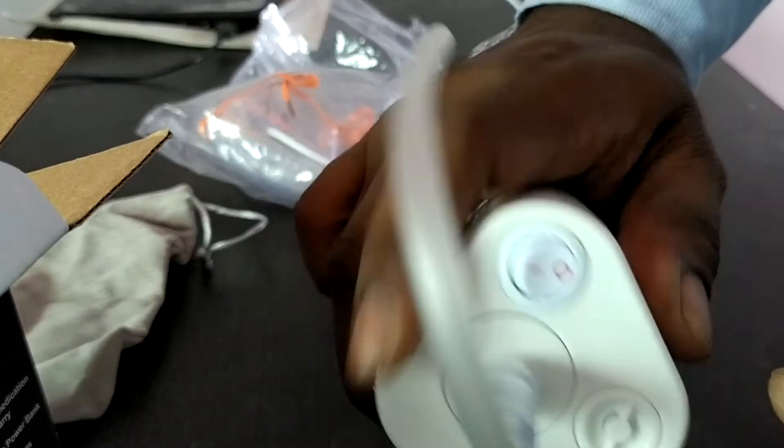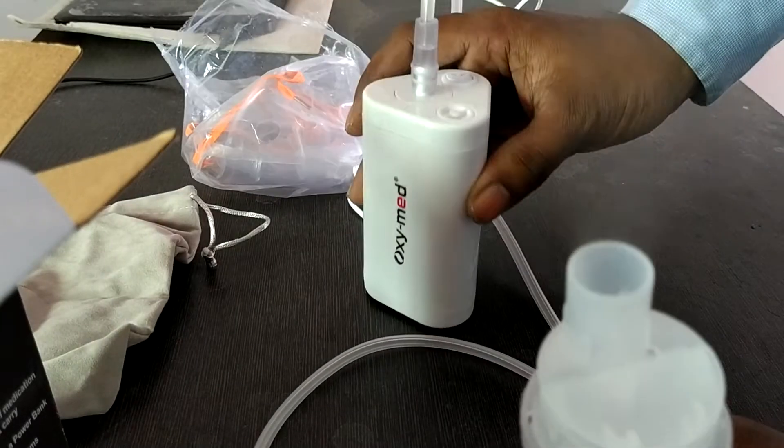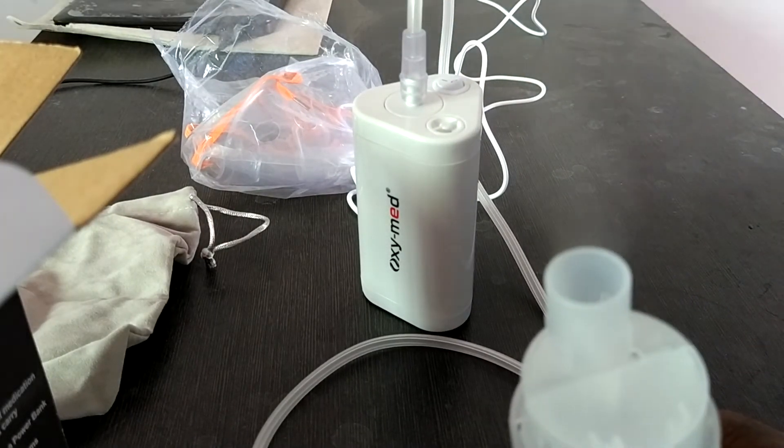Then just start the machine from here. The mask will be connected here. This is a total piston-nebulizer. Now, the machine is connected here.